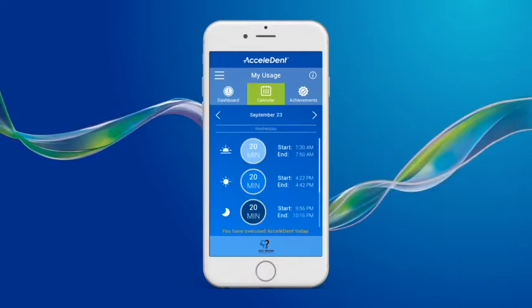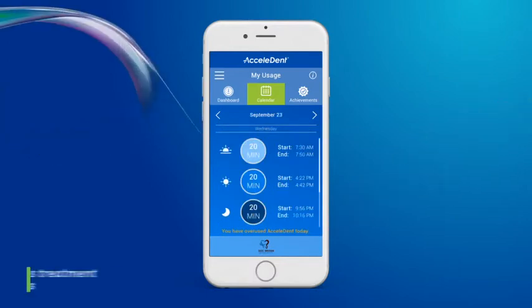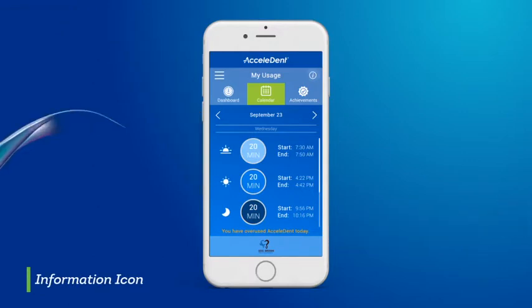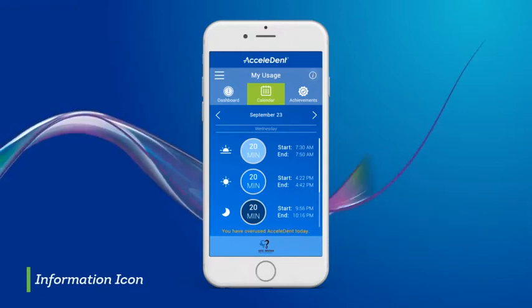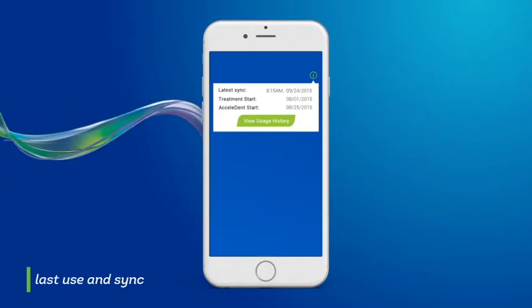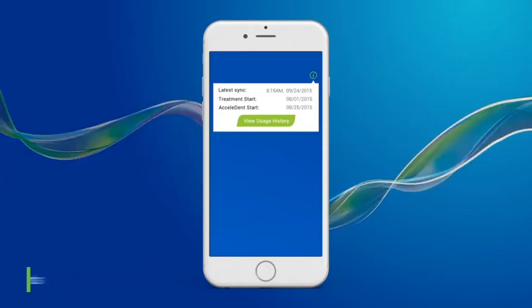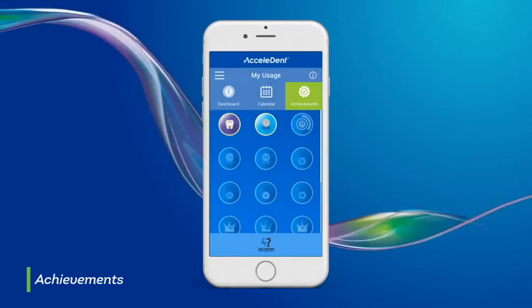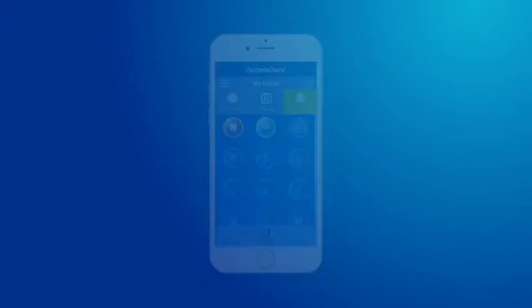You will also be able to tap through each day to see the times of your previous treatment sessions. The information icon located on each page can also be accessed quickly as a reminder of when your last use and sync with the Accelident app occurred. On the Achievements screen, you will see awards you have earned and the awards that are still waiting for you to unlock. After your Accelident activator is fully charged and the app is set up, you are ready to start your first treatment session.